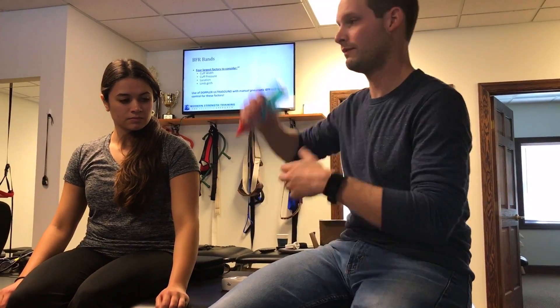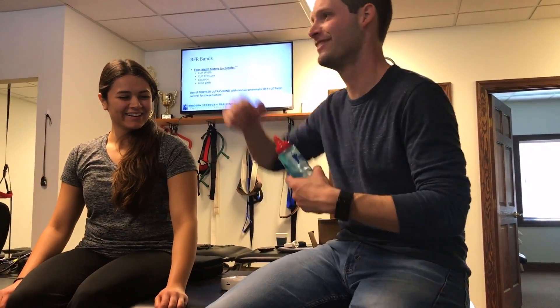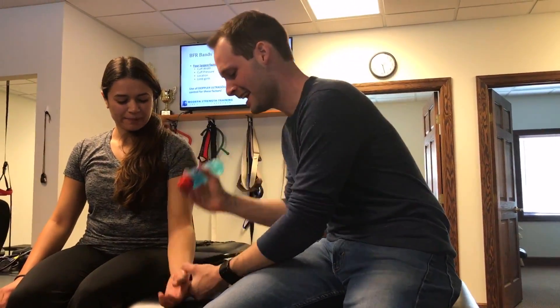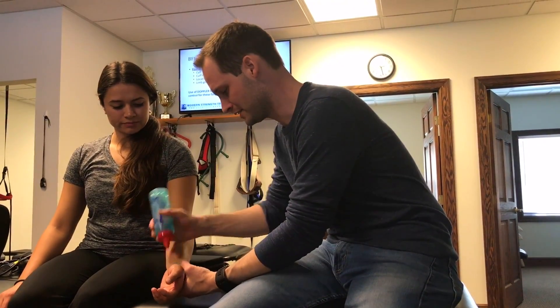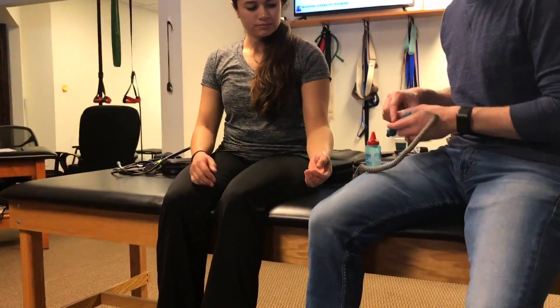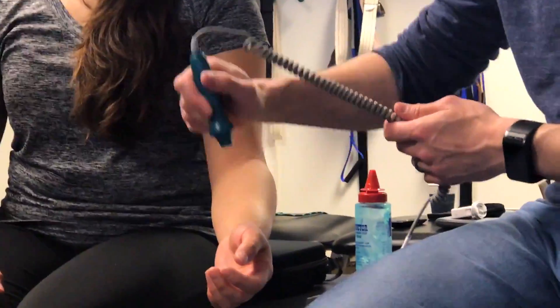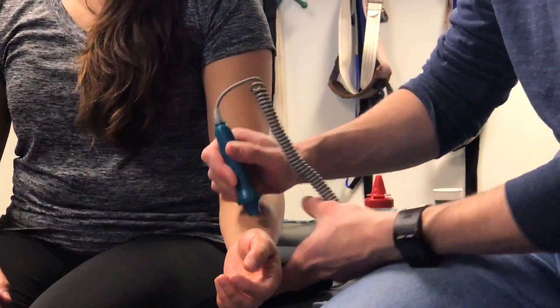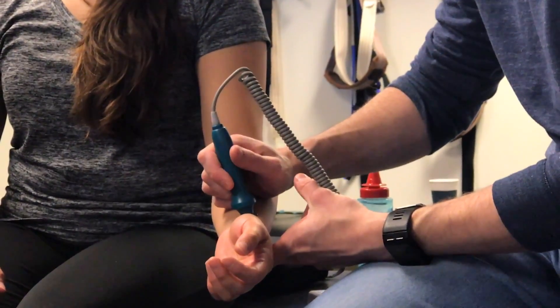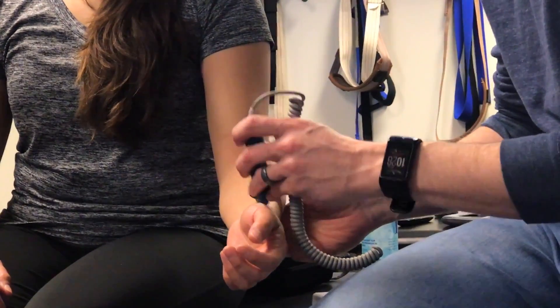Just a little gel — don't use too much. And then it is as simple as don't put too much pressure. I don't always like to go directly vertical, perpendicular, because if you do, you tend to occlude the vessel a little bit more. I like to do a little bit of an angle.